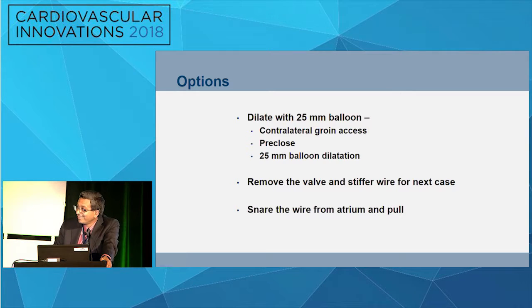Go ahead. I think the other thing you could do is, like when we go from radial and you can't pass the guide, you use balloon-assisted tracking. You could blow up that balloon on the Sapien at the tip and pillow it across. It is a good point. You've got to have guts, because if you do that, then it is a one-way road, a one-way street.